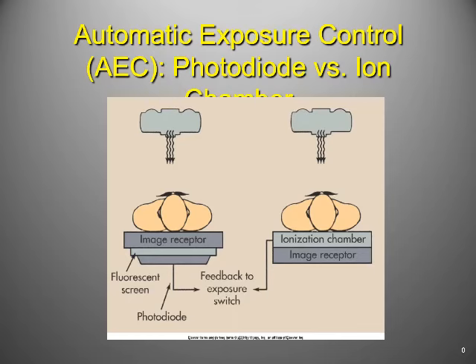Like I said, some techs will call it a phototimer. That's old school stuff, right? No tech currently alive was probably still alive when phototimers were actually being used. I'm trying to think. Yeah, they were developed in 1942, right? So I doubt there's actually any real phototimers out there. Phototimer just sounds nice and neat. It sounds like photosynthesis or something.